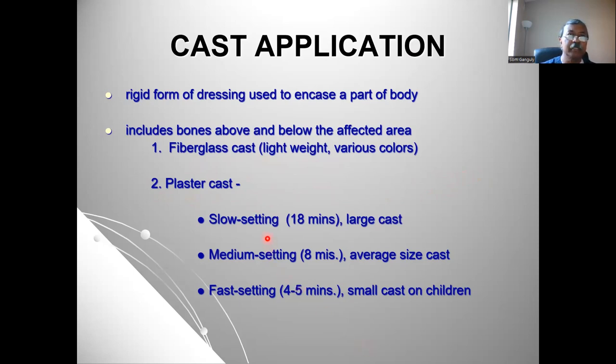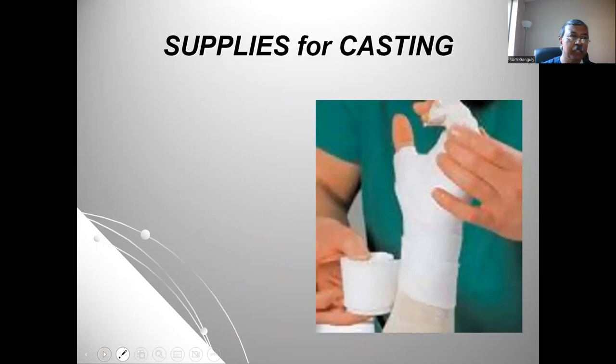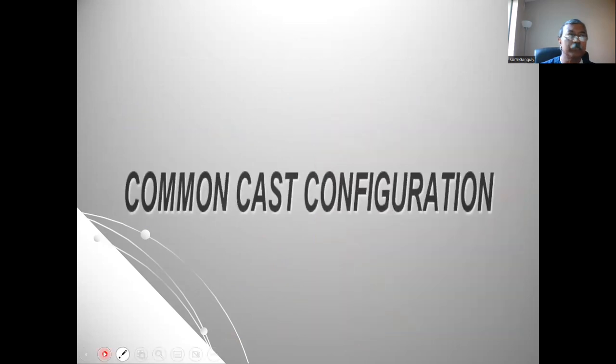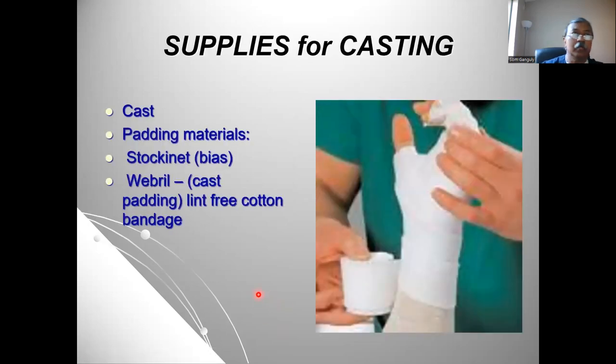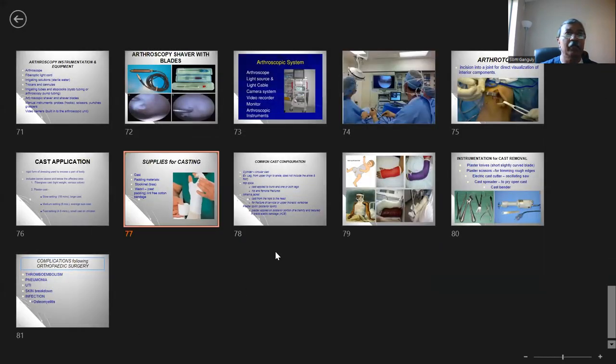Cast can be slow setting, medium setting, or fast setting. So depending on the nature of the cast the surgeon uses, you can use the cast material and padding material, stockinette material, web roll, and water for the cast material to form. And this is how the surgeon will apply the cast to immobilize the bone. To immobilize a bone, that is why the cast is being applied.